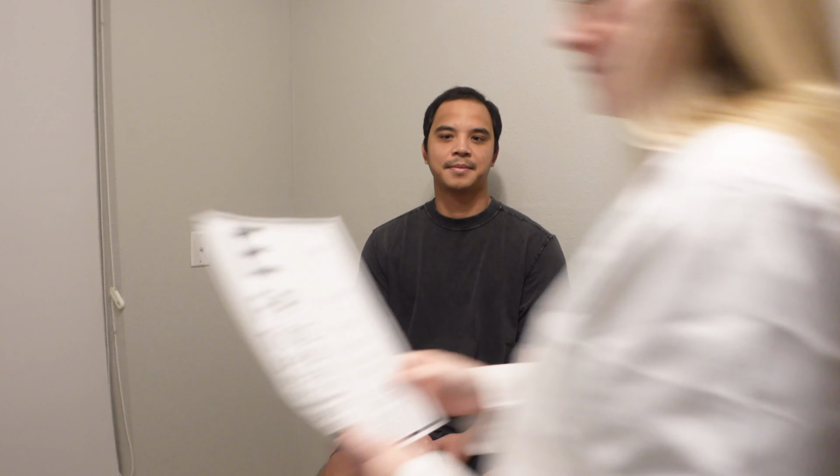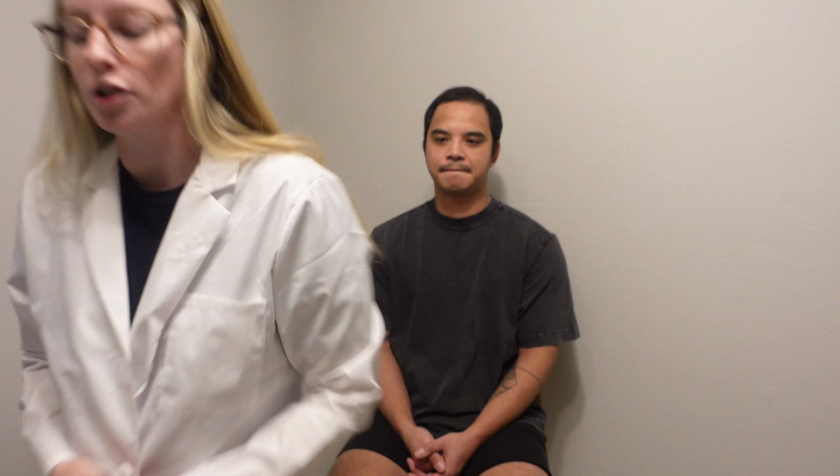And then the next thing we're going to do for the eyes is test the vision. So I'm going to use a Snellen chart. Okay, so with my Snellen chart, which we've all probably seen before with all the letters, I'm going to stand 20 feet away from the patient and then have him read the lines the smallest that he can. And then it says what the vision is, the 20/20, 20/30, 20/40, etc. So I'm going to be 20 feet away, and then go ahead and just read the line that's the smallest that you can see. P E Z O L C F T D. Excellent. And that made his vision about 20/30.